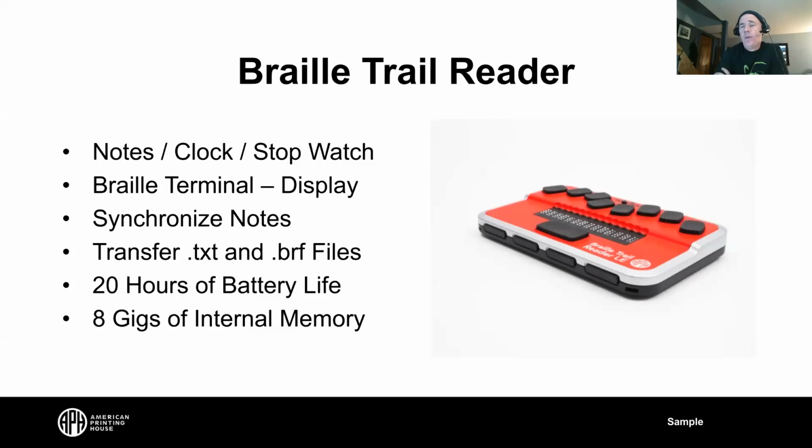And I'll just say, for our purposes today, we're really going to zero in on the notes, and we're going to zero in on using it as a refreshable Braille terminal with an iOS device. Peter and I hope to queue up another session down the road where we'll get into transferring materials such as TXT and Braille files between the two.